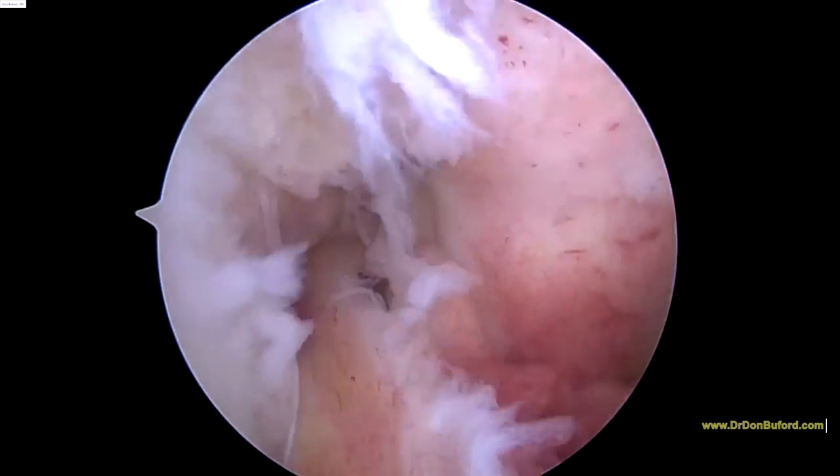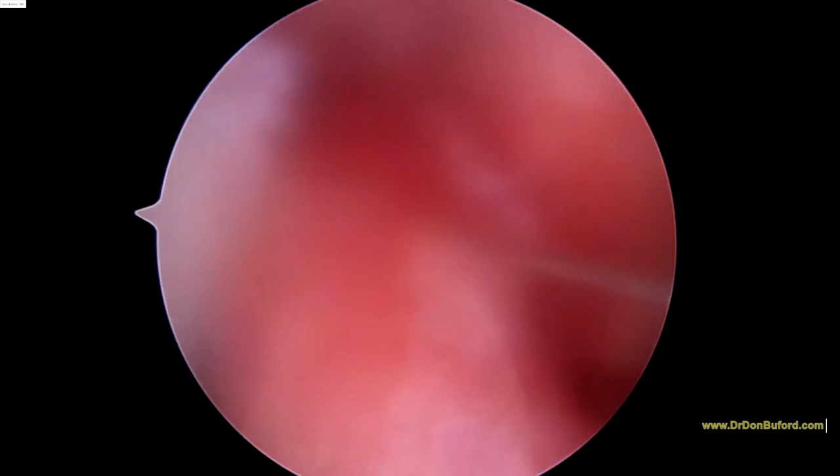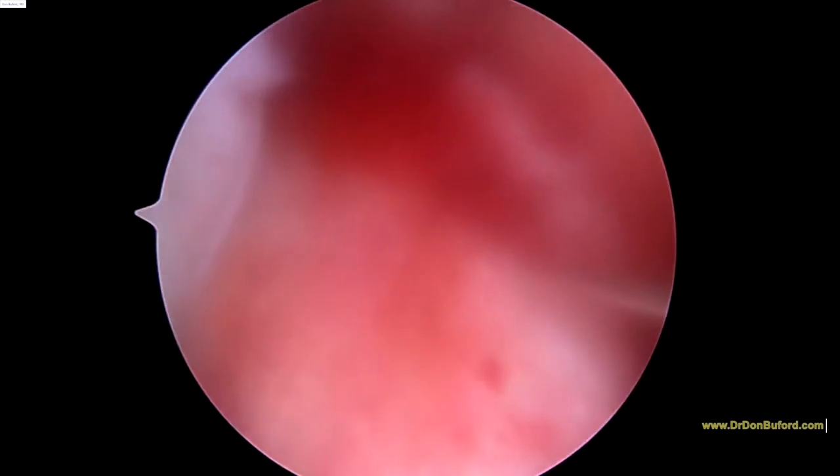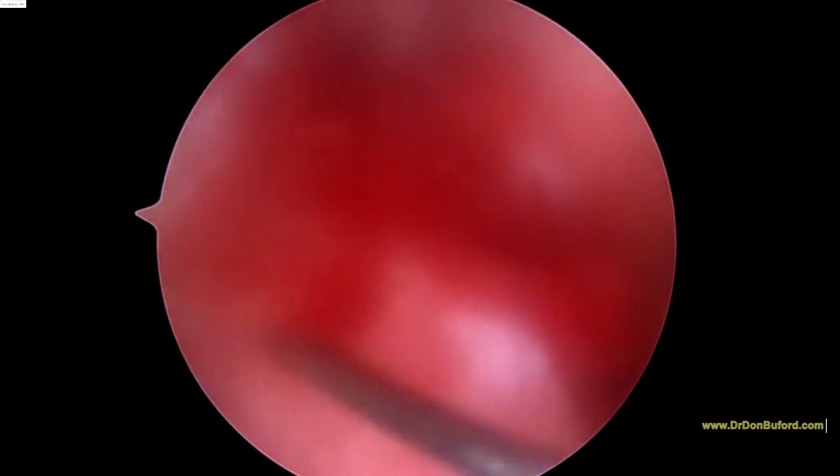Now we're going to have a look at the ACL. We've got the fluid turned off, so it's a little bit cloudier picture, but you can see where our needle's located. There's the needle tip right there.